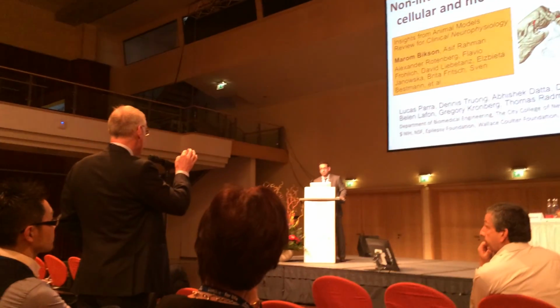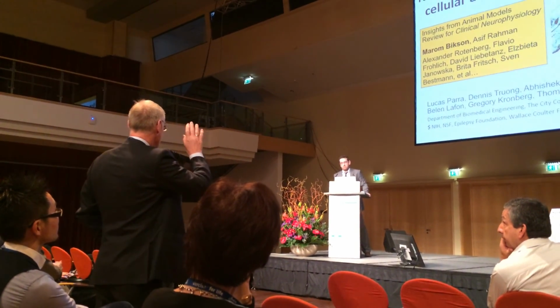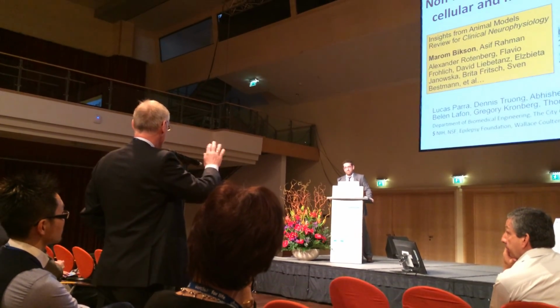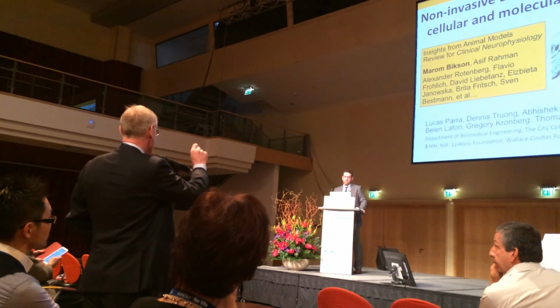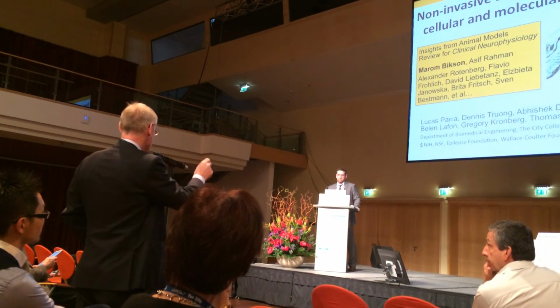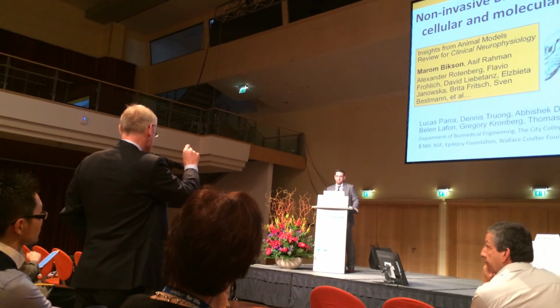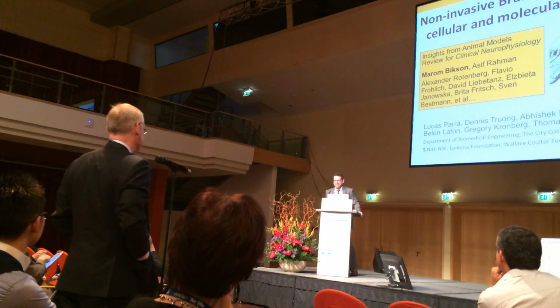We have a very simple paradox, which is MEP development under anodal stimulation increases at rest and decreases under cathodal stimulation. However, during motor tasks we have completely different effects, so this would have to be explained by the model. A lot would have to, yes.